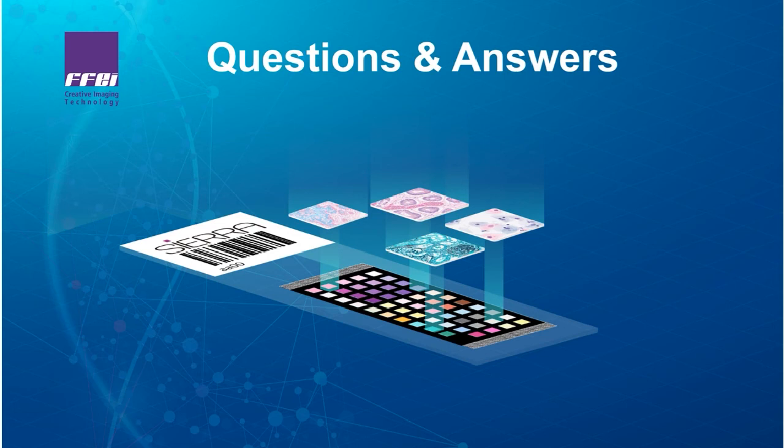But in perhaps the more modern scenario, where there are multiple people using multiple scanners, different models, different manufacturers, you can also apply these profiles at the point of viewing. For example, in a viewer you're developing yourself or an AI system you're developing yourself, these profiles can be used to convert all of the color data into a standardized universal color space, for example. And therefore, there's also the opportunity for FFEI and end user and commercial viewer vendors to work together to implement this in, let's say, a Sierra toggle switch, for example. And this enables raw data to still be kept as raw data, and at the point of viewing, switching on the Sierra ICC profile to standardize those images for either your AI purposes or your human diagnostics.